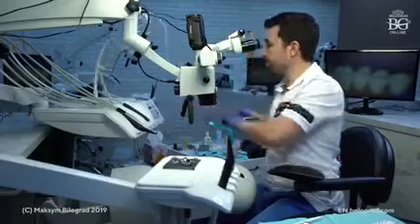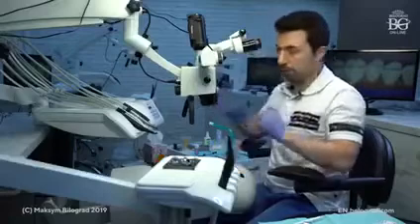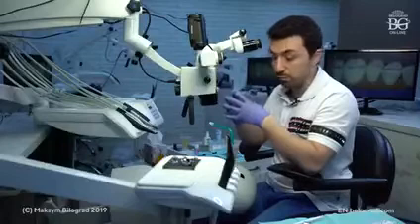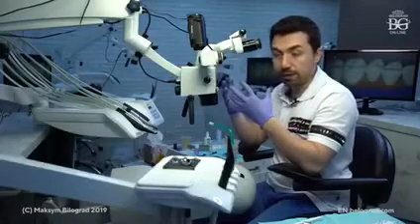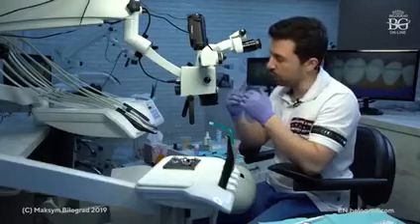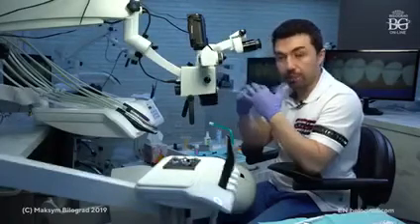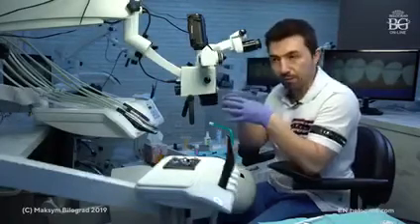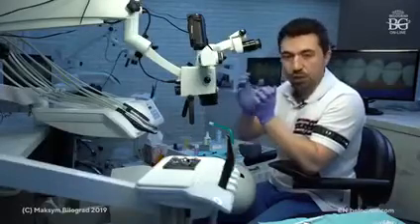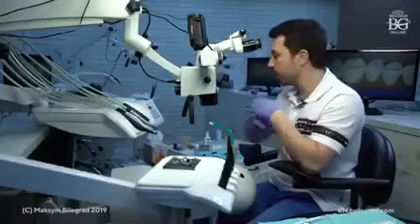is if you want to make, for example, the finish line thicker, you can do it with a thicker burr. Okay? If you would like to keep your finish line the same as it was done previously, basically we make it 0.3, and you would like to keep it 0.3, you can use a thicker burr, because sometimes you can get your burr number 14, the previous burr, a little bit deeper than half of the tip, and in this case you may have a small U margin, small lip margin. Okay, and with a thicker burr you can take this lip off in a really easy way.